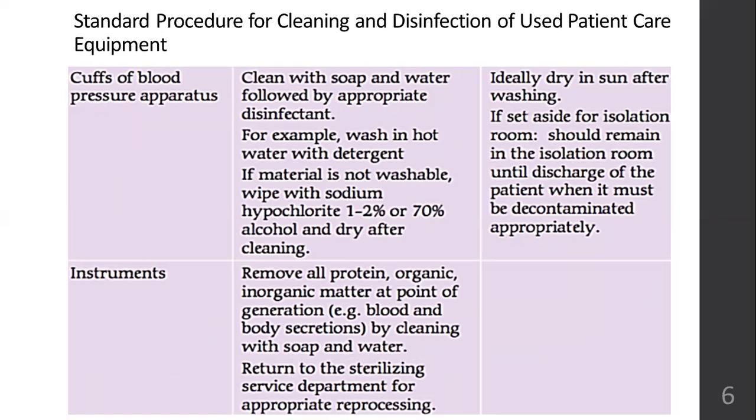Then cuffs of blood pressure apparatus, clean with soap and water, followed by appropriate disinfectant. Again, wash it in hot water with detergent if possible. And if it is a non-washable material, then wipe it with spirit or sodium hypochlorite. Okay. And if you have washed it, sun dry it and then use it.